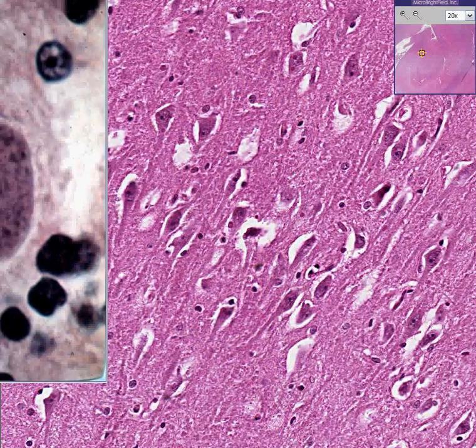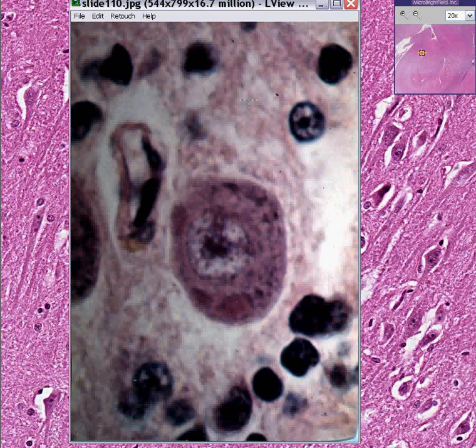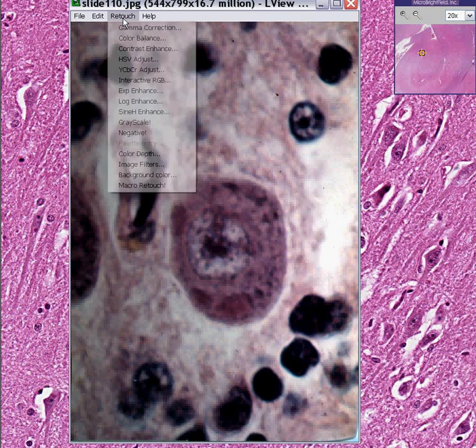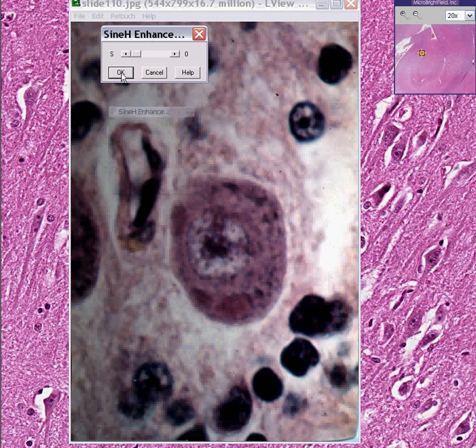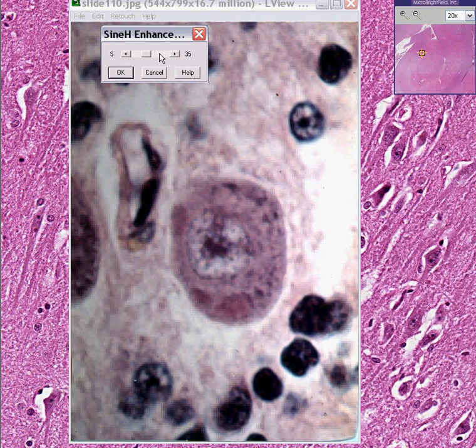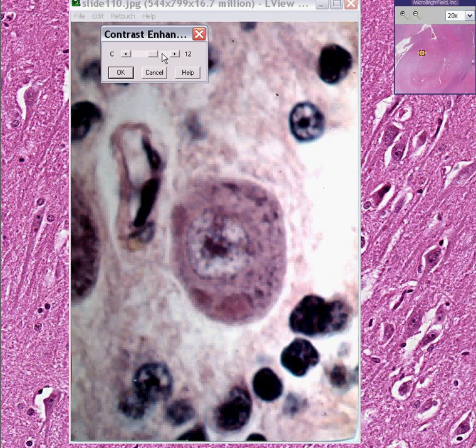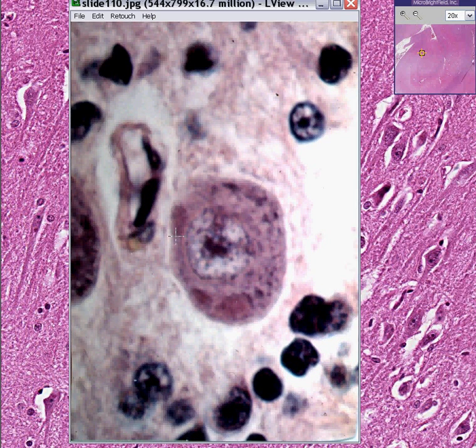I'd like to show you an even better picture of one, which I was lucky enough to find by Googling. This is a neuron — you can see clearly the nucleus here — and you can see this granularity within the cytoplasm. I'd like to do a little digital trick here with a filter called Sine H Enhance, which kind of brightens the whole picture up but buffers the high end so you don't get too much bleaching. After that, I give it a couple of clicks of regular contrast. Now you can appreciate red, variable, irregular, intracytoplasmic inclusions within neurons.